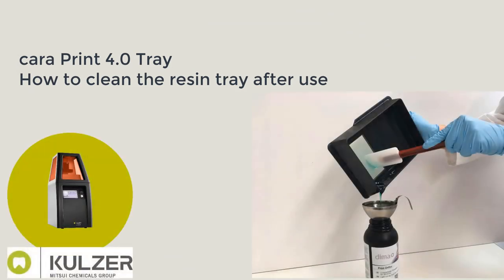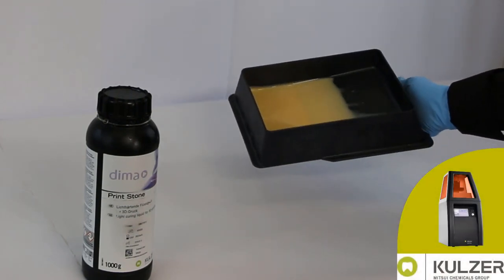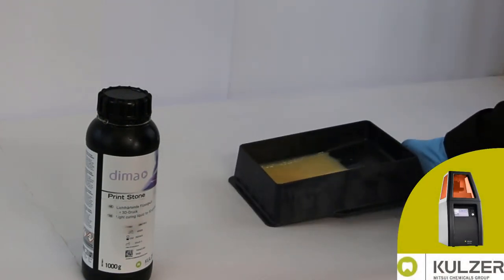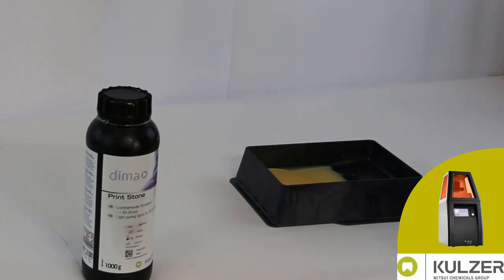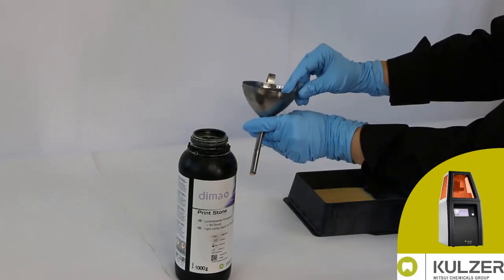This video shows the cleaning of the resin tray after printing. After printing, at the latest at the end of a working day, the photopolymer must be filled back into the bottle since small particles can fall into the liquid photopolymer.